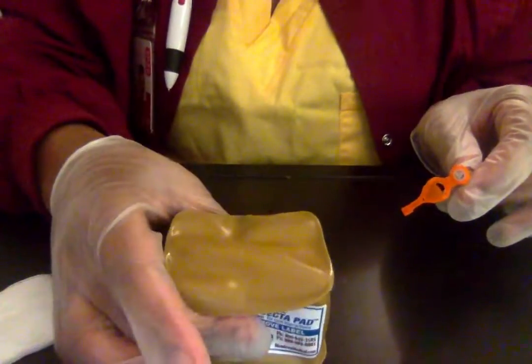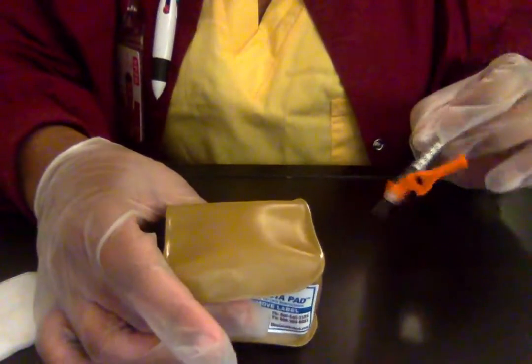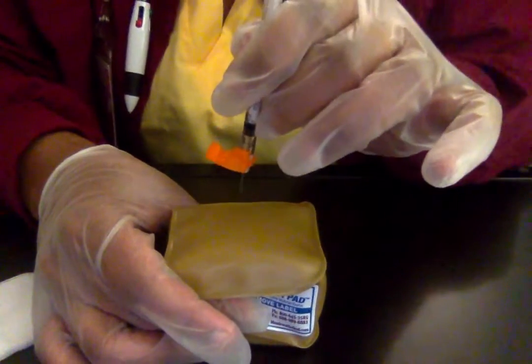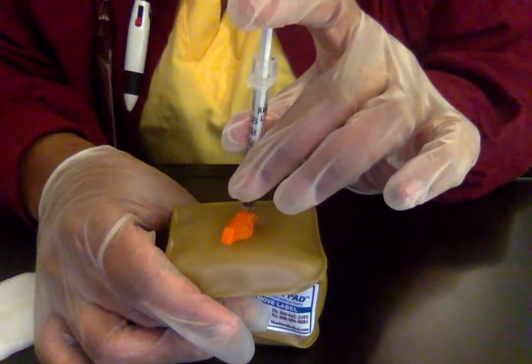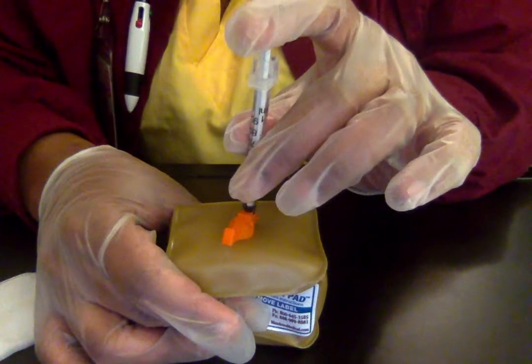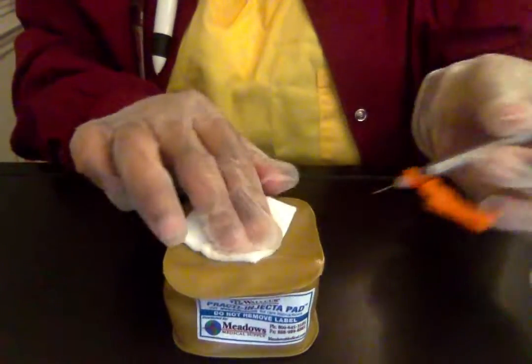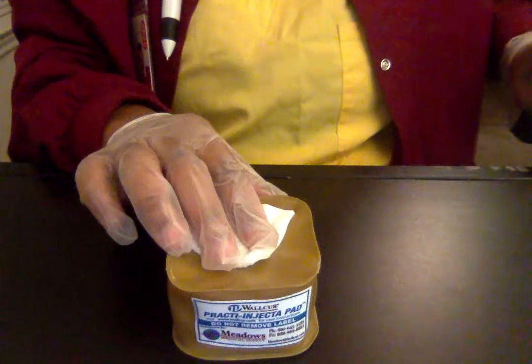to give this injection. So with the sub-Q, we want to make sure that we're pinching that skin so that we're right there in that sub-Q. So now I'm just going to go ahead with my injection. Insert. Let the patient know that I'm injecting them, and once I'm done, I'm just going to go ahead, apply some pressure, and initiate my safety mechanism.